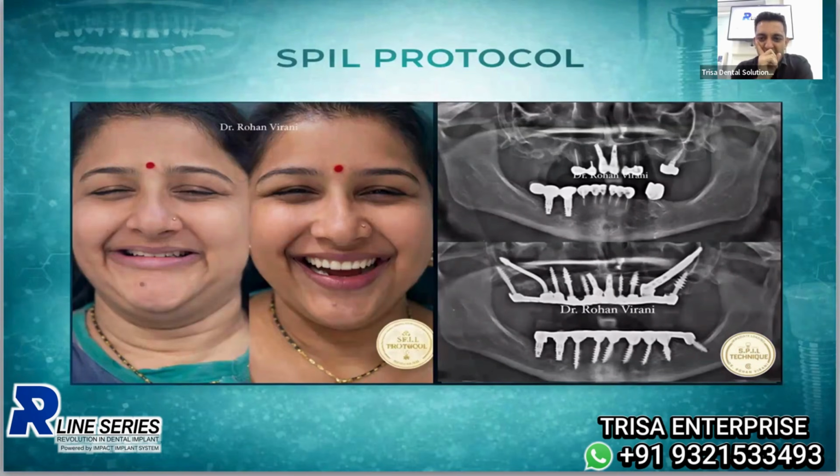I do my zygoma on one side. On the other side, the moment I put the conventional zygoma, I don't get torque. In the chair, the procedure is flipped to a basal zygoma because it has a wider disc at the base, and I get amazingly high torque, which is needed for doing such cases. I complete the other implants with BCS in the anterior maxilla, as you see.